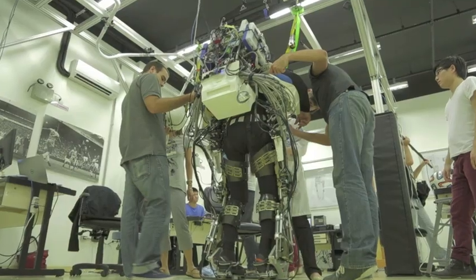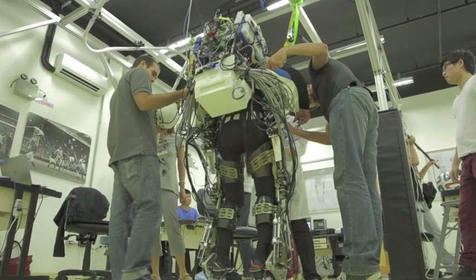The LED system is for the EEG feedback. So they're actually imagining that they want to move their left hand or their right hand. They're not actually doing it, but they're imagining doing that. And the EEG system is detecting that they're imagining left versus right. And so there's an LED system on each side of the eye that tells them they're thinking right or left.